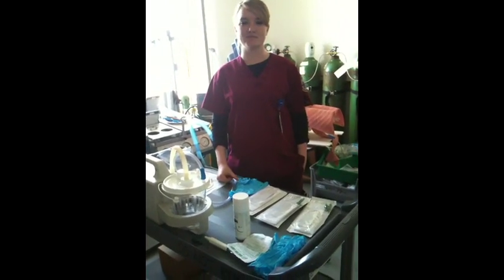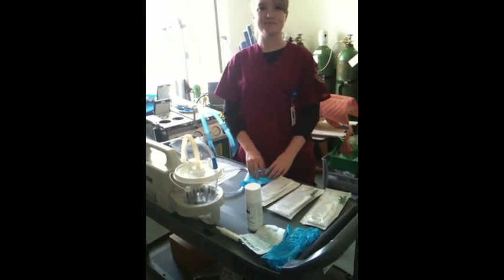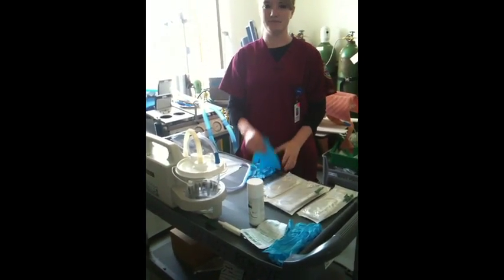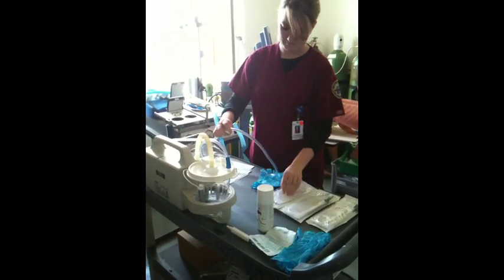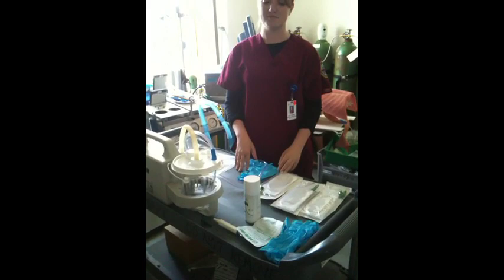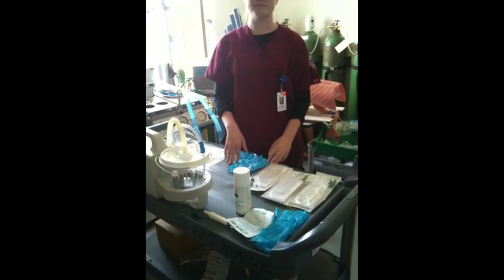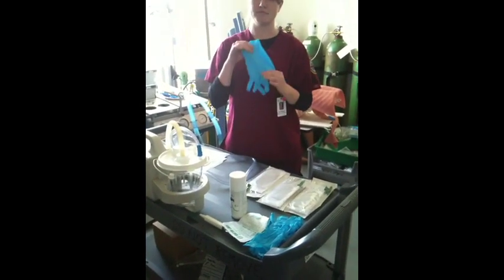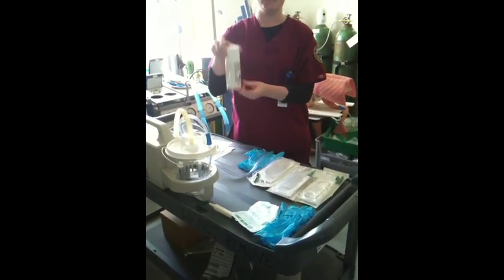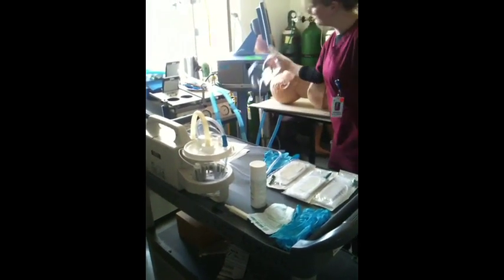The second step would be to assemble and check equipment. When you suction a patient, you're given a suction kit, which includes a suction catheter with a thumb port, sterile gloves, and a basin for the sterile water or saline. A gown and mask is required, but goggles are optional. Lube is necessary for the catheter, as well as an oxygen delivery system, which is our non-rebreather.